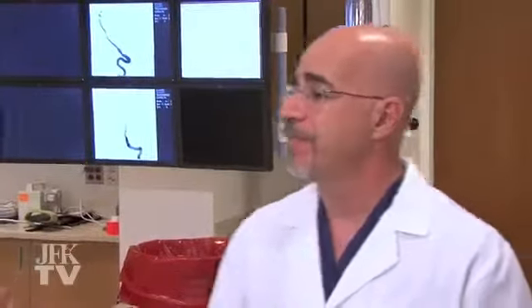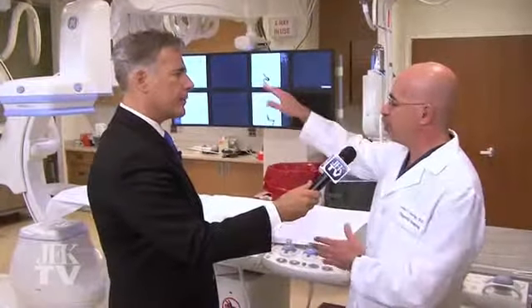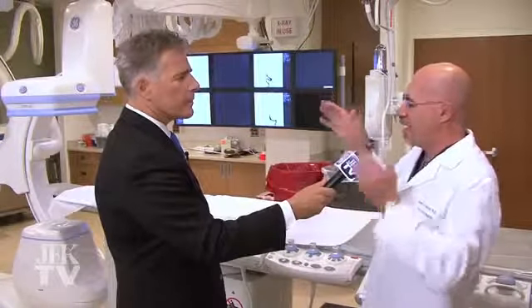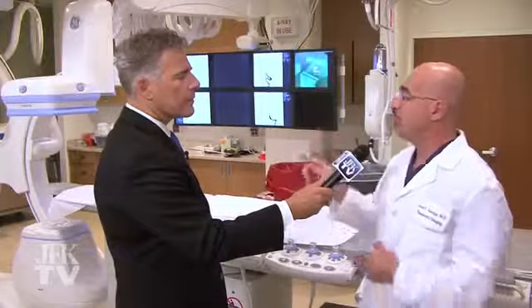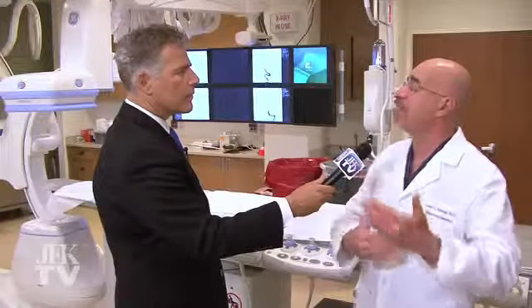and the results are quite good. Dr. George has been with JFK for 20 years, he told me before this conversation. I'm thinking, you've seen incredible progress here at JFK over the years. When this is happening, this $3 million expansion, you also told me that next door, Dr. George, there's going to be a comparable room. And by the way, how will that room be different? The only difference will be instead of biplane, which means these two imaging intensifiers or these 2 digital processors, instead of being at 90 degrees, we only need a single one because this biplane mode is necessary for interventional neuro work. We really don't need it in the other things that we do.